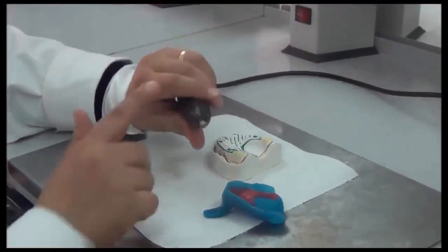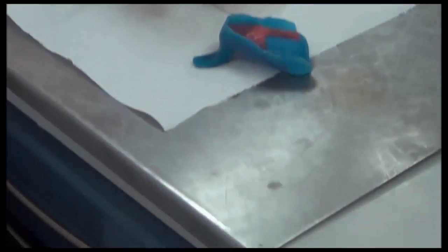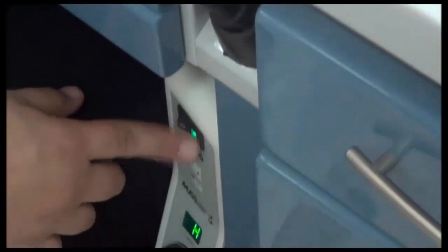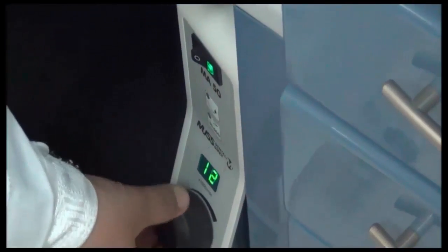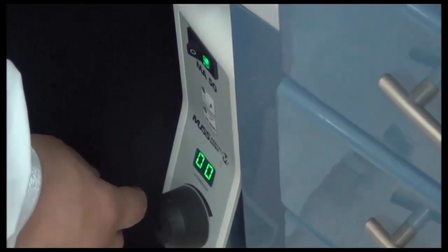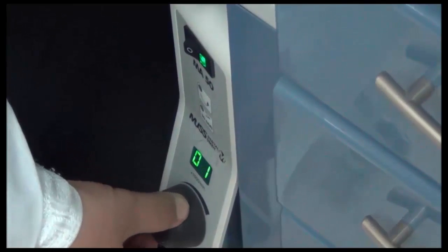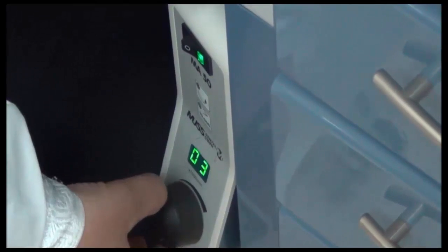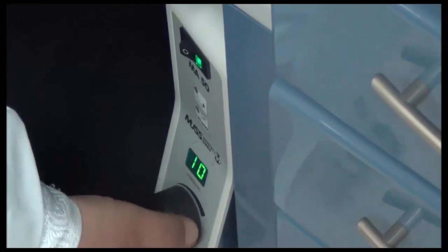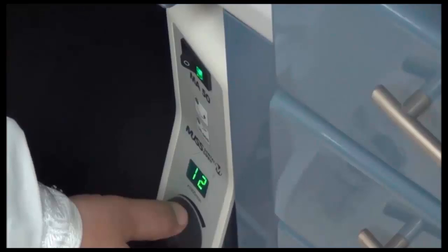We're going to use the handpiece control unit that you have on your chair. You can see here that this is the on and off button, and this is to control the speed. If I press to operate this, it will not work because it's on 0 speed. If I raise the speed, the handpiece will be working faster. You can notice that from the sound of it.